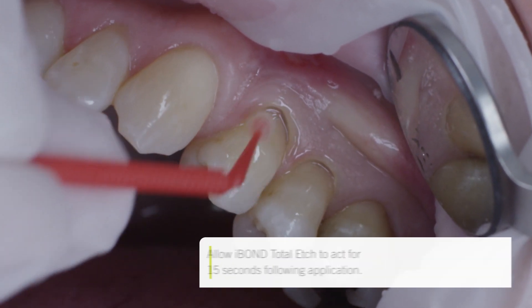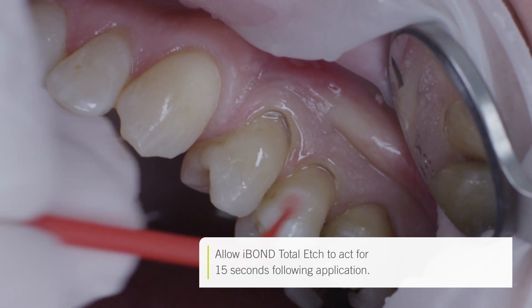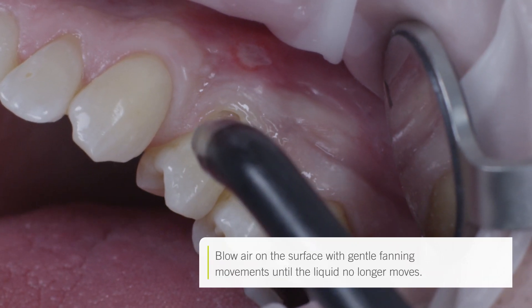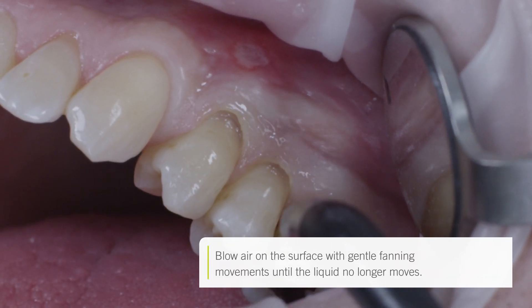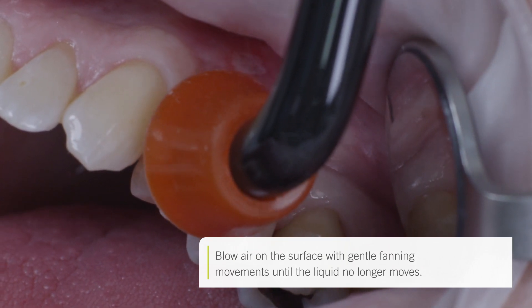In accordance with the etch and rinse technique, I-bond Total Etch was applied to the tooth surface. This product does not need any agitation. After the corresponding application time, air was blown on the material, beginning at the enamel and moving towards the dentine until an even glossy surface was achieved, which was then light cured for 20 seconds.